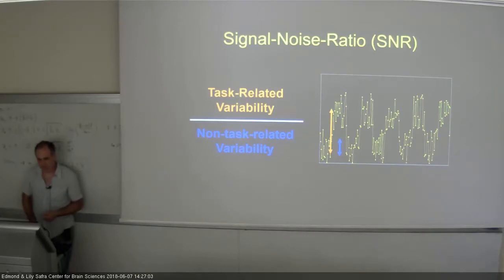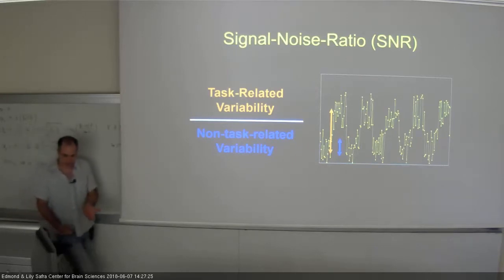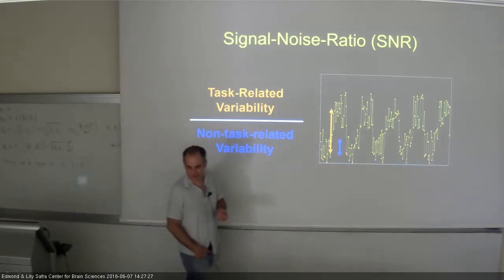And about the signal itself, everything you said is correct, but you can also do something in the MRI. You can have just a higher magnetic field. That also helps, although it also drives some kind of distortions and susceptibility artifacts are also more prominent.